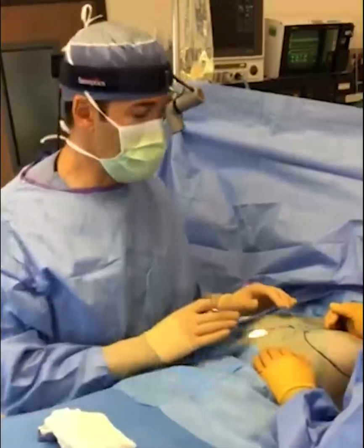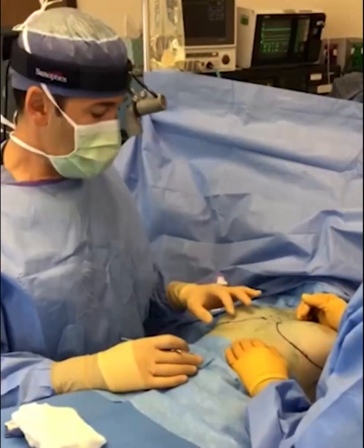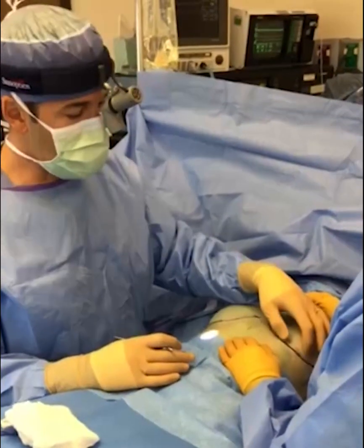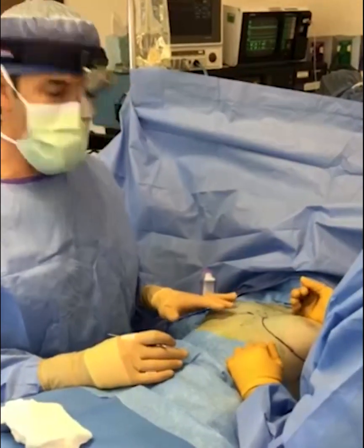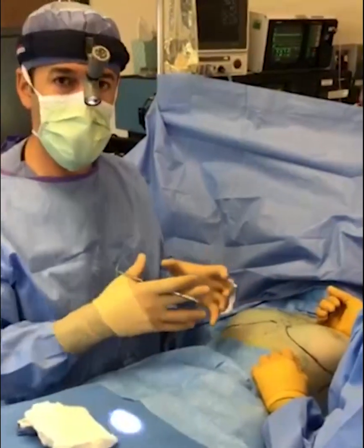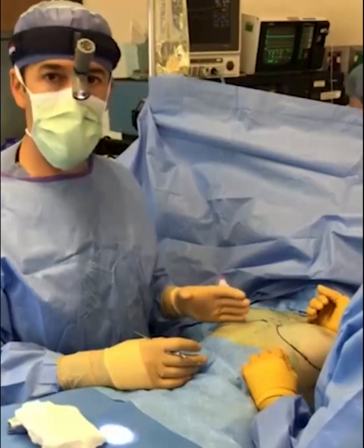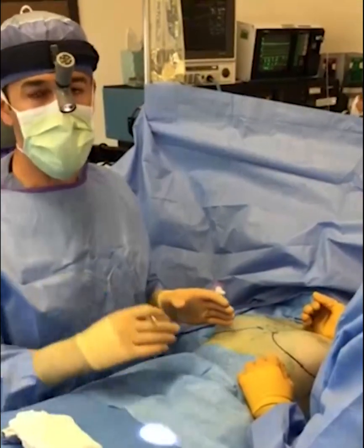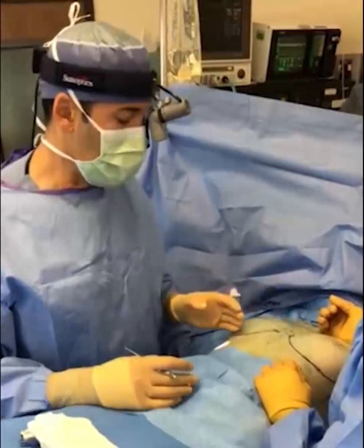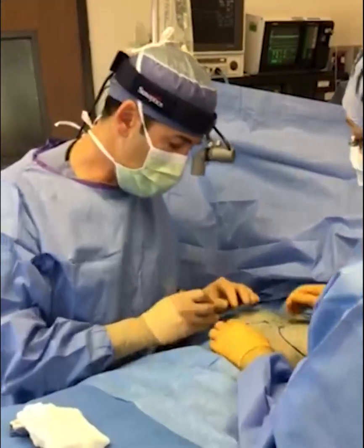All right, guys, here we are, and we're going to get ready to start. We've already injected with the local, and we fashioned 4-centimeter incisions. That should be large enough to be able to get our silicone implants in. We're using the soft touch, which is a little bit more firm gel, so we would usually require a little bit larger incision, but with the use of the Keller funnel, we can still get away with making a 4-centimeter incision. So we're going to get started right away.